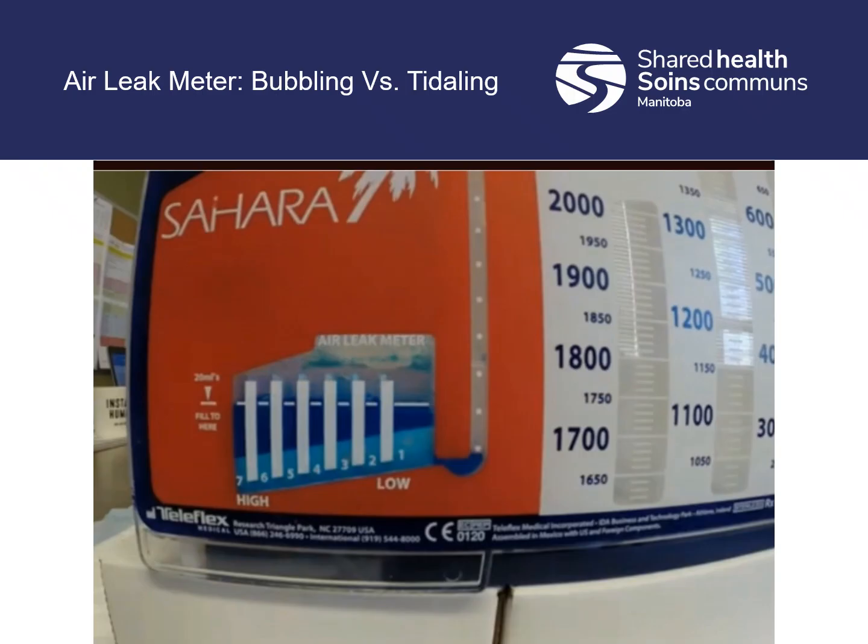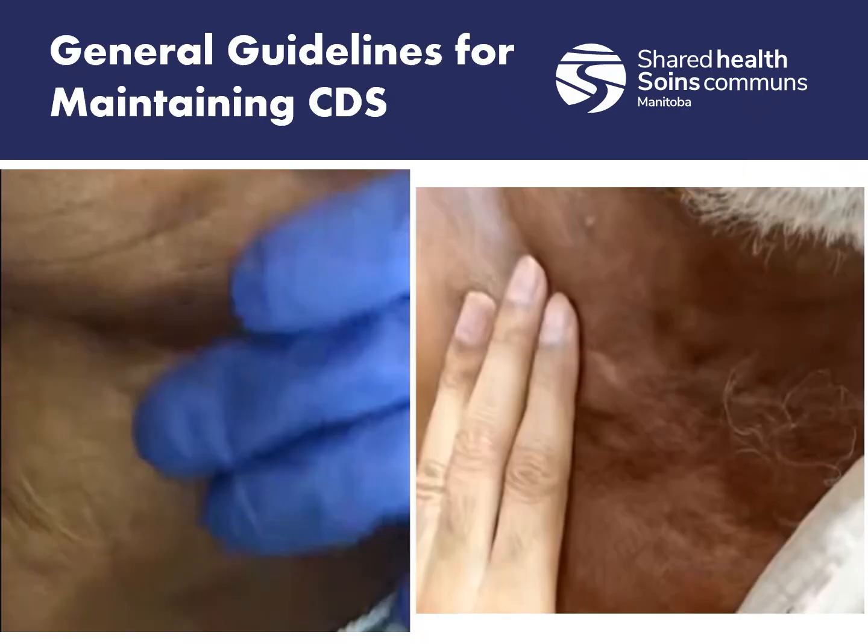So the first thing we want to do, if we see excessive bubbling, where it's a little bit of bubbling and then it just spikes like that where it's a lot, is make sure we go from the patient to the collection device, checking to make sure that any large air leaks aren't coming from a break in the tubing. Maybe the tube came dislodged when we loaded them in the ambulance. It could be an actual tear in the tubing, or the chest tube itself may have been dislodged. So this is going to be an indicator for us to check that on our patient.